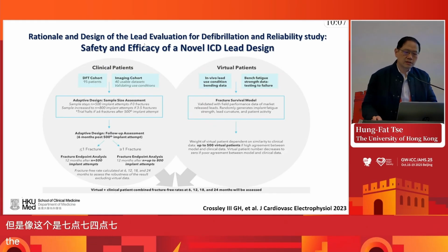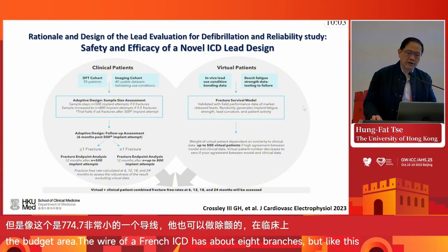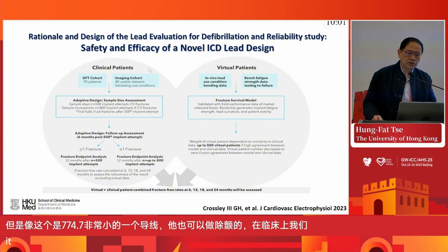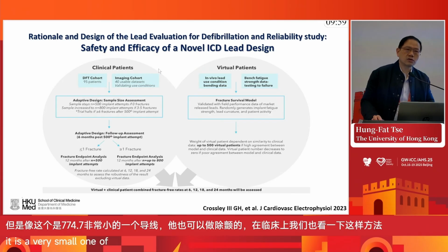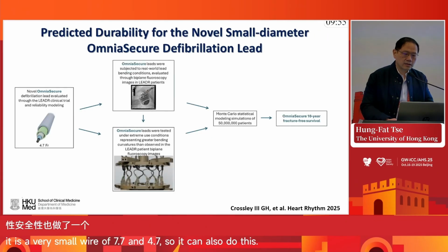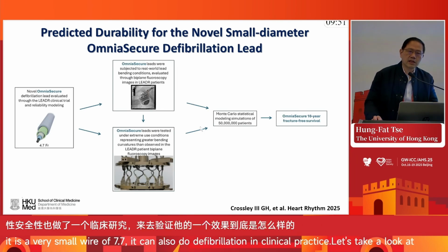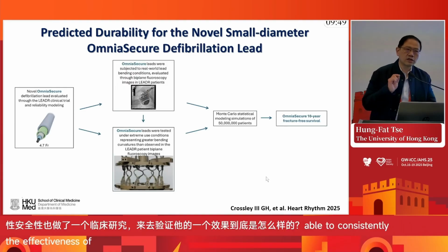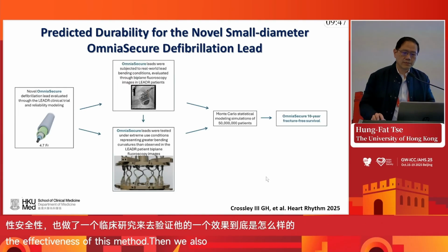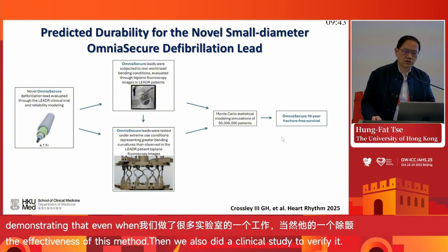It is a very small lead, but it can also do defibrillation. In practice, we tested the lead's safety and efficacy in a virtual patient, and also carried out a clinical trial to look at the safety and efficacy of this lead in clinical practice. They have gone through a lot of bench work and were able to consistently demonstrate that even with this very small defibrillation lead, you can get a very good 10-year fracture-free survival rate compared to a conventional lead.